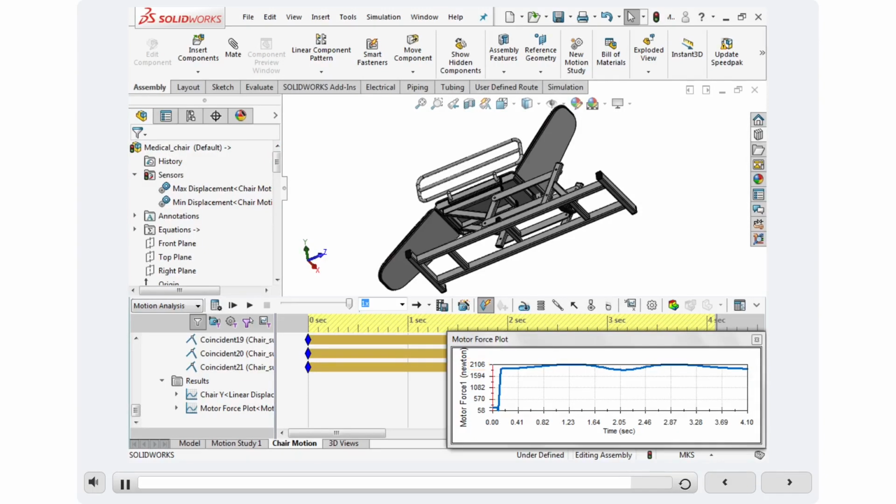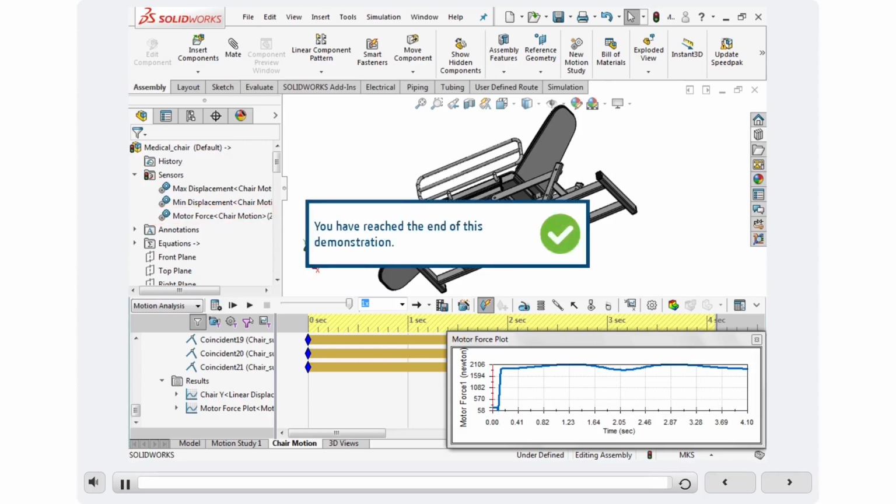Now, we will add a sensor for maximum force with the sensor type set to motion data, motion study set to chair motion, and motion study result set to motor force plot. We have created the sensor named motor force for the maximum force. That brings us to the end of this demonstration. Click Next to continue.